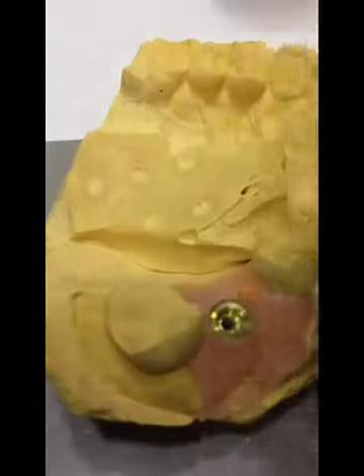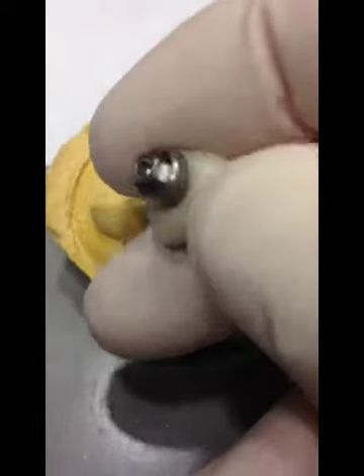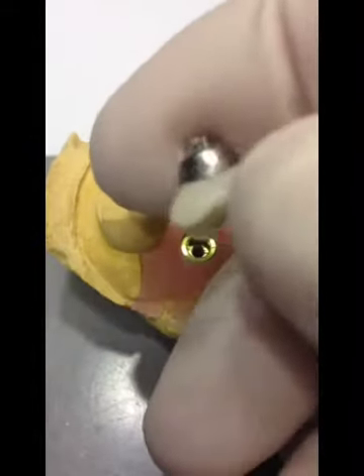The great thing about this is it's retained on the abutment with cement, but we can just take it off, clean off any residual cement that might be there, make sure the margins are good, and go from there. So that's the final restoration.